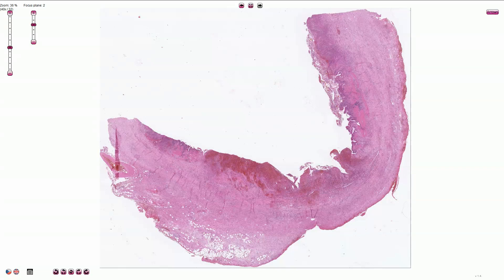When we block the duct anywhere in the body, acute inflammation behind this block usually follows. It is a general principle and it also applies to the gallbladder. This is an example of chronic fibroproductive cholecystitis with a superimposed acute inflammation or acute exacerbation. Clinically, it is usually associated with chronic cholelithiasis, where the gallbladder stone causes sudden obstruction of the outflow.